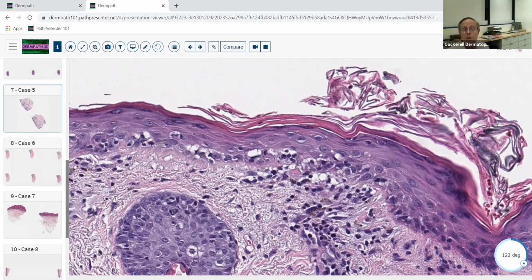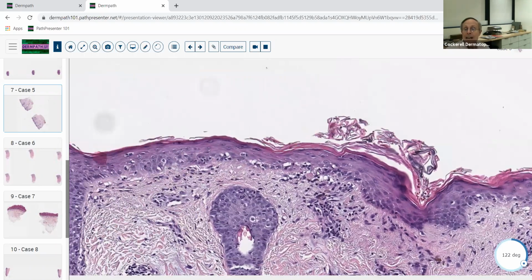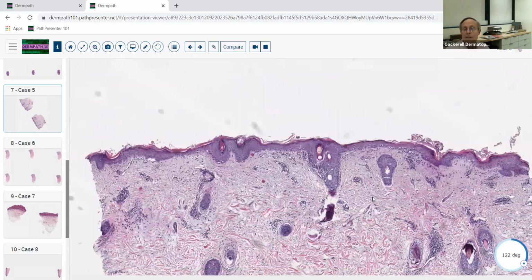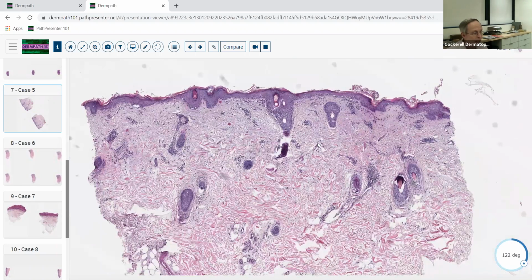So we couldn't just tell you for sure whether this was lupus or dermatomyositis or even a lupus-like drug eruption. So really all we would say here is vacuolar interface dermatitis consistent with one of these connective tissue diseases. But when you see this pattern, you should definitely think of that. So this is a beautiful example of that pattern that we see in these diseases. Again, vacuolar alteration, scattered individual necrotic keratinocytes, and a sparse infiltrate of lymphocytes. So all of those things would go together. And in this case, it happened to be dermatomyositis. There actually, again, was some mucin in the dermis. Not a lot, but some was present in that specimen here.